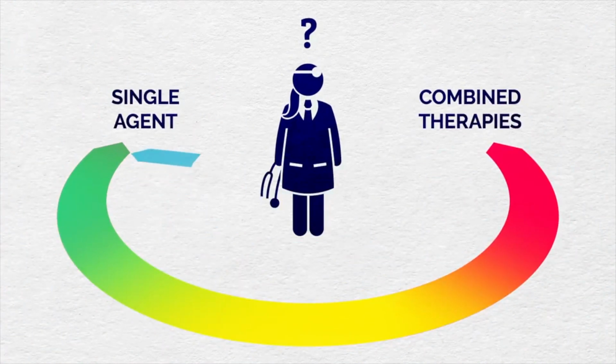The DoMore V1 CRC marker may also refine the risk stratification of patients who should be offered adjuvant chemotherapy, which could be used to guide treatment choices. Patients at high risk of cancer death may be offered the more aggressive combination therapies, while other patients may prefer a less aggressive single-agent chemotherapy.